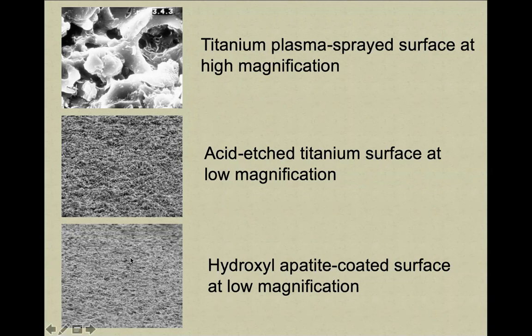It's pretty irregular, and this allows the bone to grow inside these microscopic pores to hold the dental implant much more effectively.